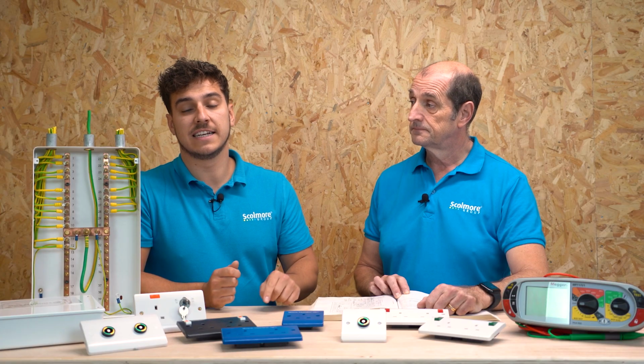Is there anything else you want to add? Just make sure you remind people there's an annual check to do. Correct, yeah. Make sure that you're testing these annually.